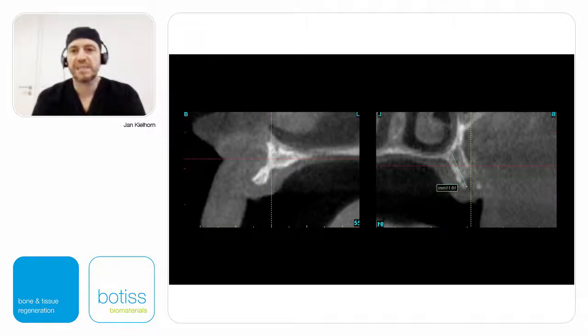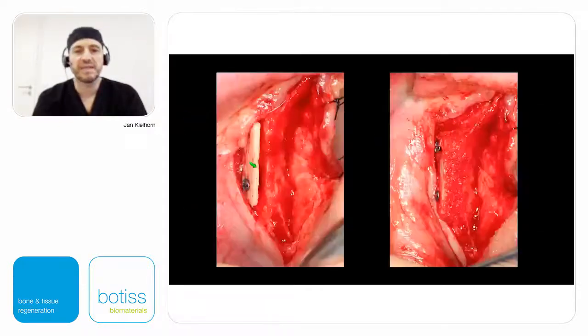You see cases like this where, of course, you will know it is very difficult to do some augmentation. You will see that there's a very thin bone. Splitting would not be the favorable option here. So you see that this is very very thin here and very thin here. So of course the splitting might break off the bony wall. In these cases, of course, augmentation with the bone wall is something very easy to do.